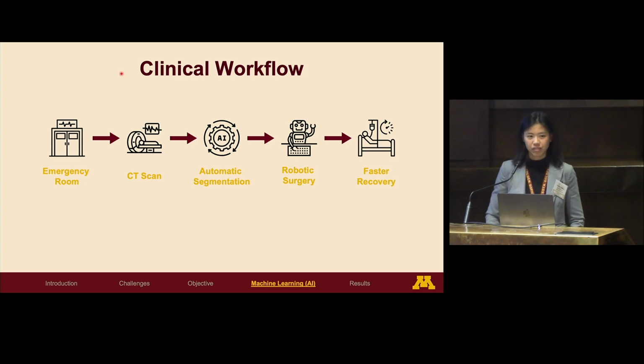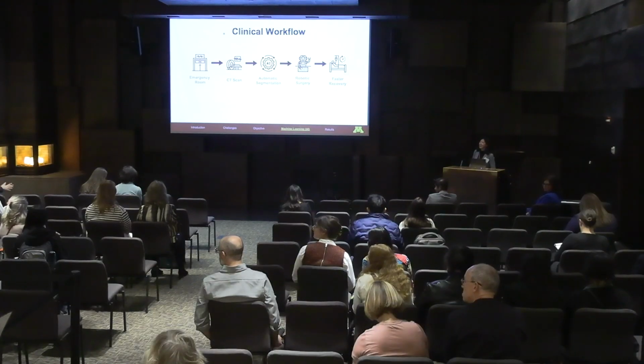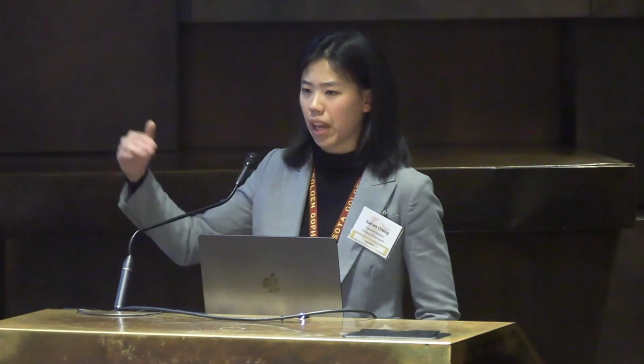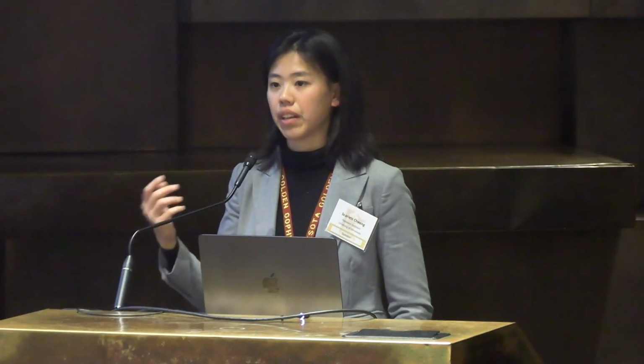If no one has other questions, I have another one. I'm a neuroscientist by training, so this is interesting to me. What kind of standard 3D brain template did you use? Do you use several of them to get a good scan of a typical brain? Yes, for each patient they usually only have one CT scan, so that's the choice I have. But if I have multiple CT scans, I will choose the one closest to their surgical date, which has the biggest hematoma on the CT scan so that I can segment it really well. That would be my template.